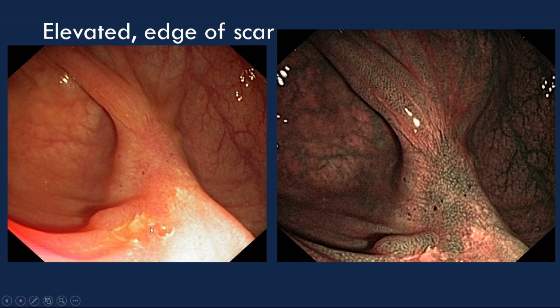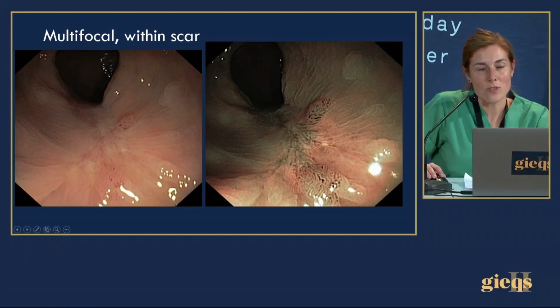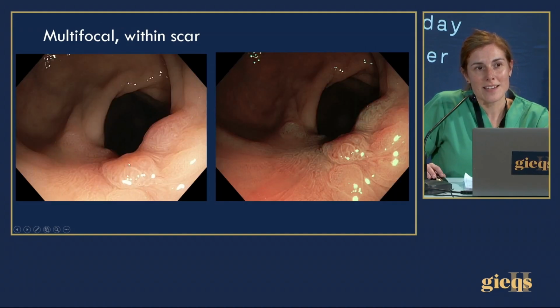That's why you see the scope position is almost longitudinal to the fold, just so you can see the complete scar and wouldn't miss any bits of it, because if you looked in forward view, you might just see one side of the fold and miss the bit of recurrence which is at the back. And here again, a nice scar with actually 2 foci of recurrence. And again, I think I asked David, should I put this many slides in of recurrence? He said repetition is key.